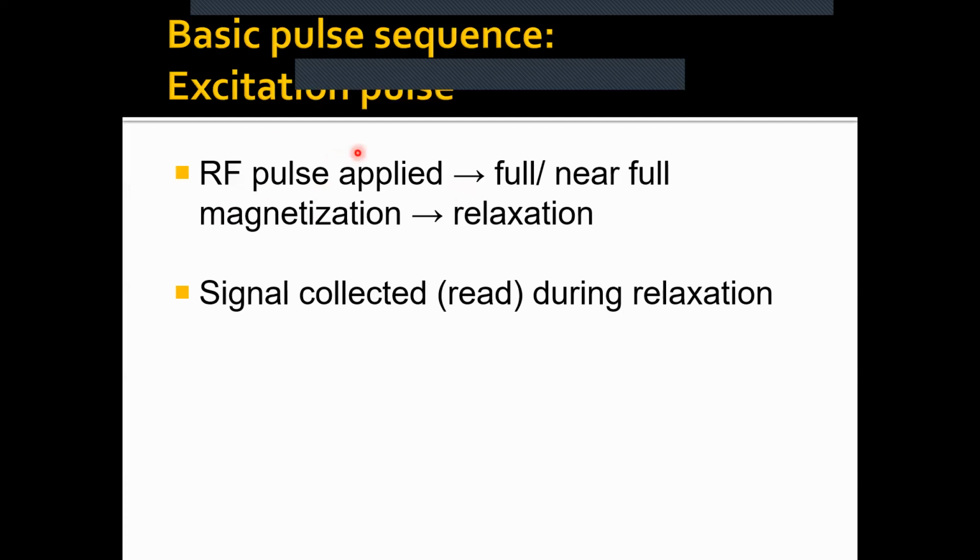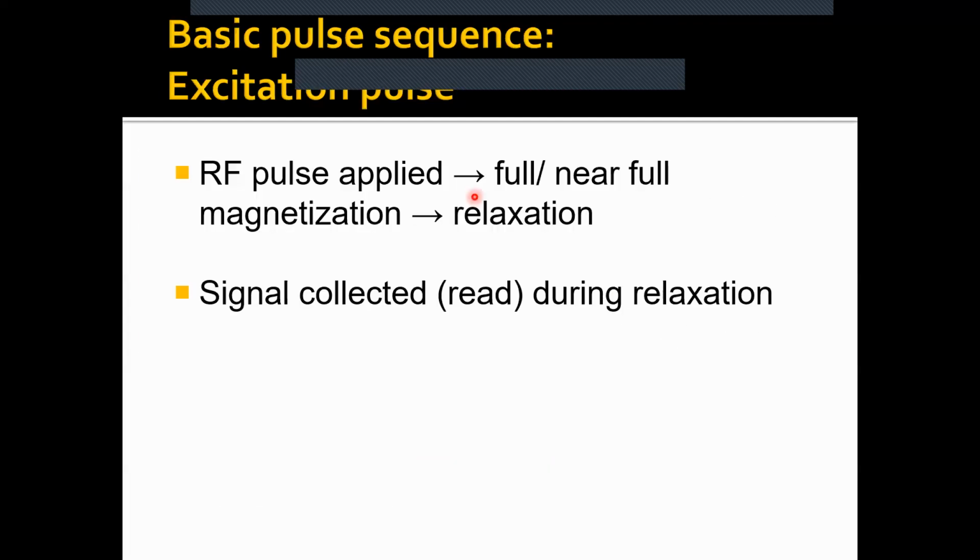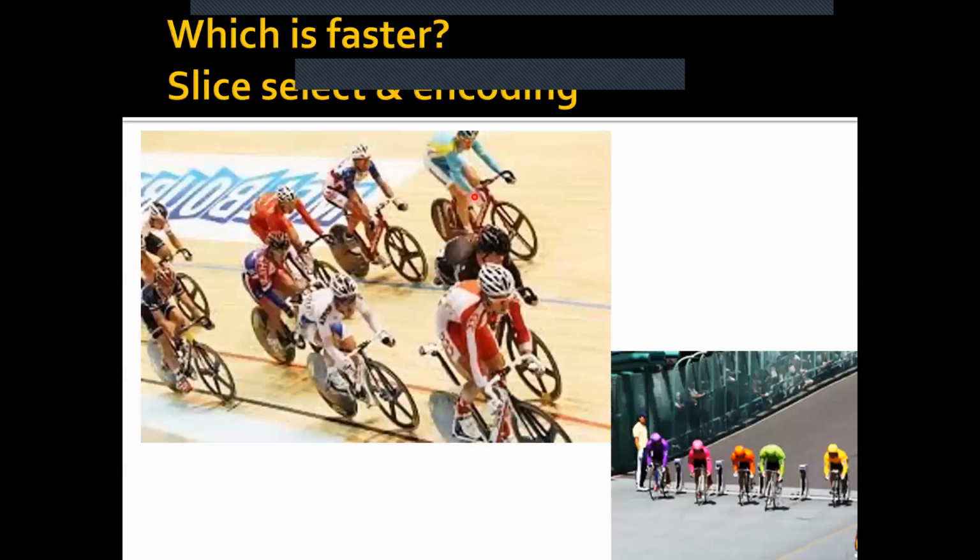So this is basically describing that. We're applying the pulse, you magnetize the protons and align them to the magnetic field, and then they relax again. And when they relax, remember how I said that the pulse applies energy to the protons? As they relax, they'll release that energy. And this is where we get the concept of T1 and T2 images.